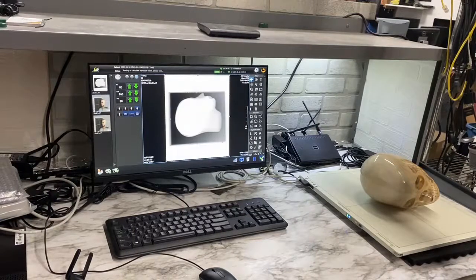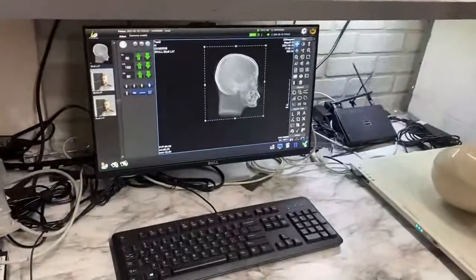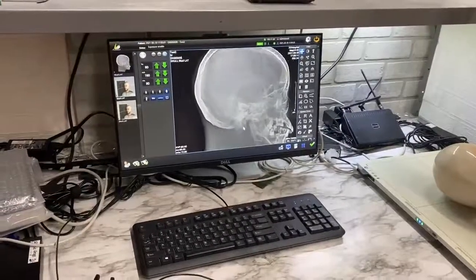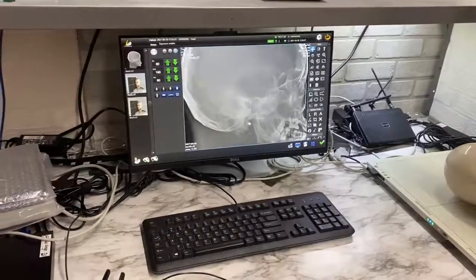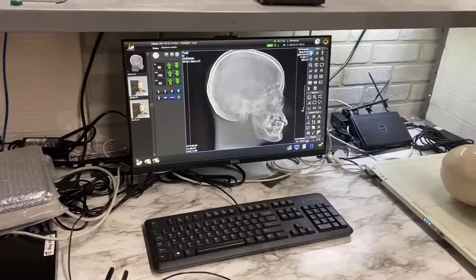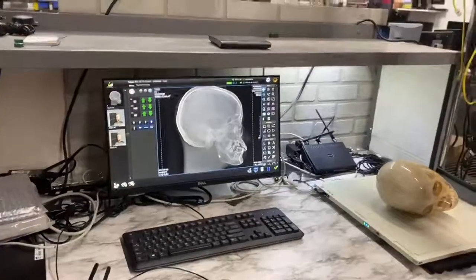Okay, and this is the pre-processed image that comes up — it does kind of an auto-collimation there. And there is your finished image. Very good image quality. We've got a lot of manipulation tools on here, but basically it's meant to be sent to a PACS for final diagnosis.